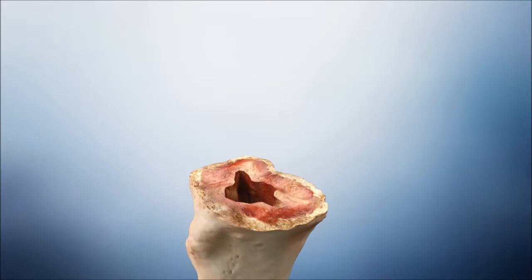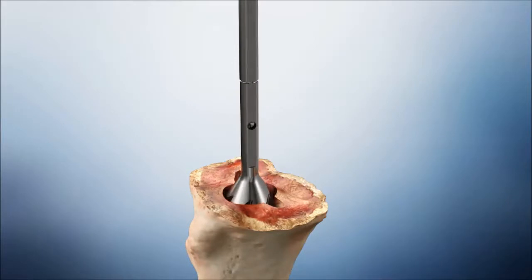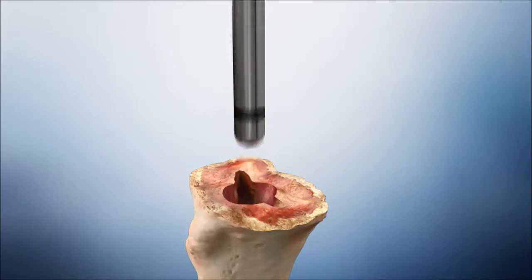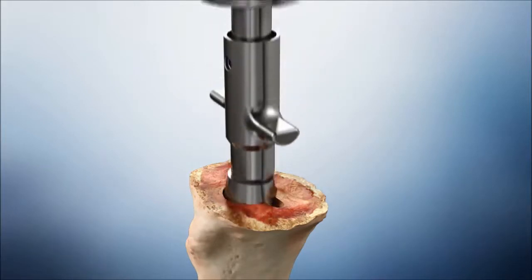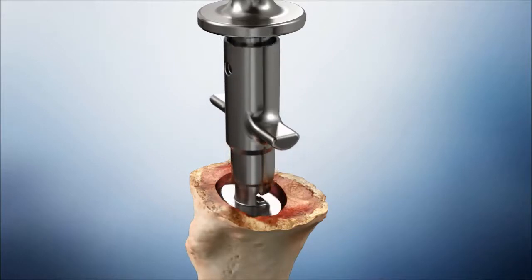With the appropriate size stem trial assembled to the cemented MBT revision tapered reamer, ream to the planned proximal tibial resection level. Assemble the appropriate size stem trial to the smallest tibial broach and impact into the tibia until the top surface of the broach is at the desired proximal tibial resection level. Sequentially broach until the broach is rotationally stable in the canal. Remove the broach handle, leaving the broach in the canal.